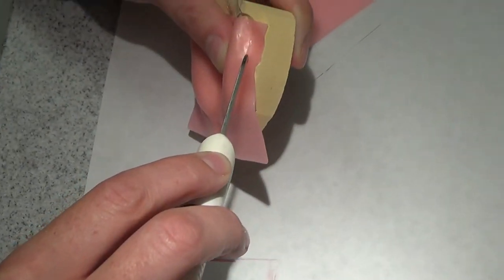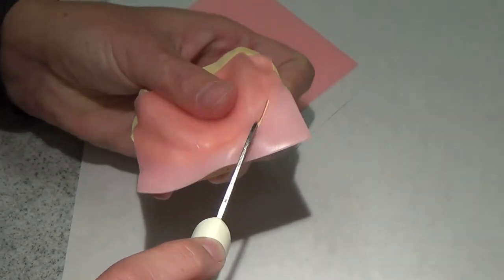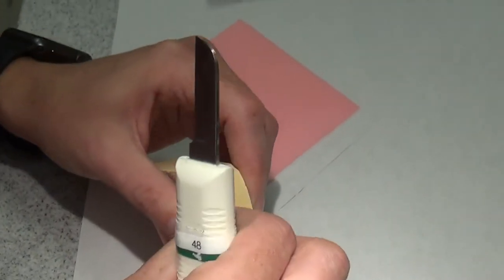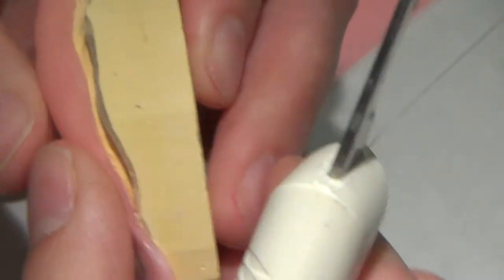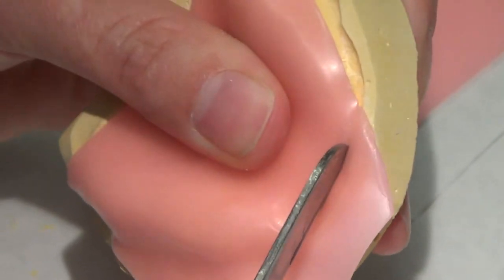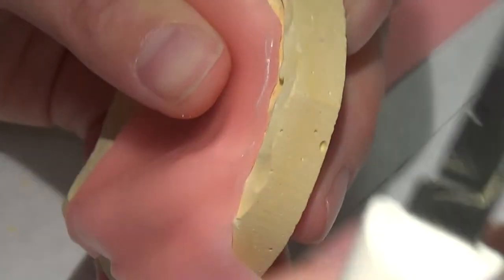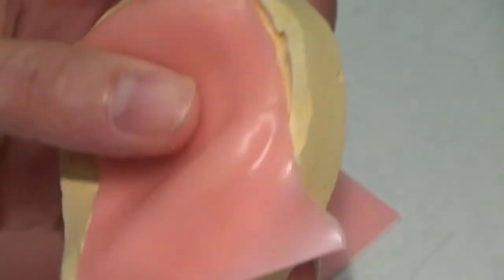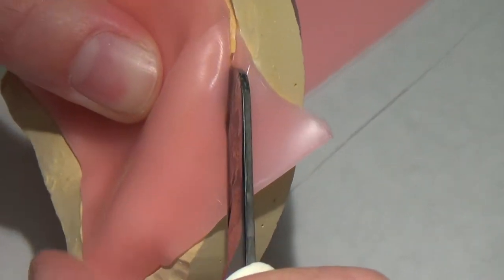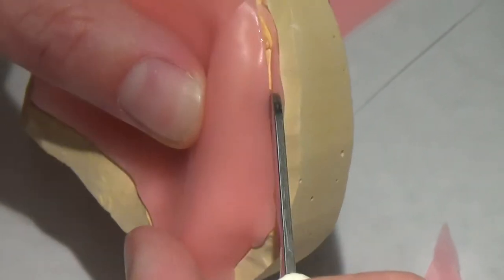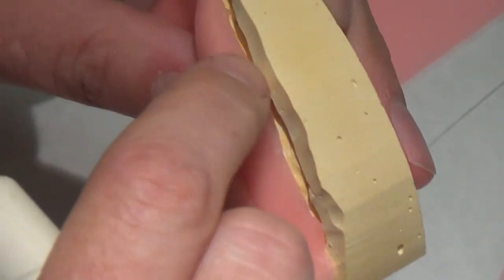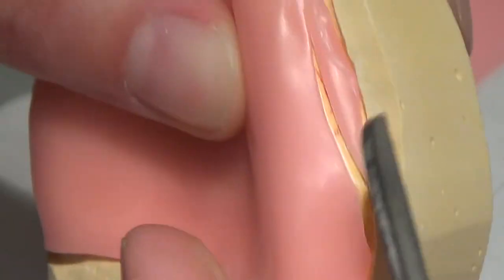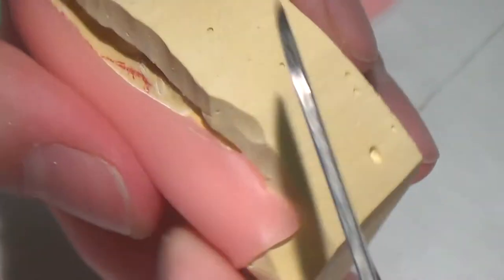You're going to see in a patient like this, my lines are much harder to adhere to because my reference is so much shorter. I don't have a lot of control over where I'm going. So I have to be more diligent coming back and readjusting until I'm happy. But if you notice how a warm blade will trim this wax very easily and without breaking it.